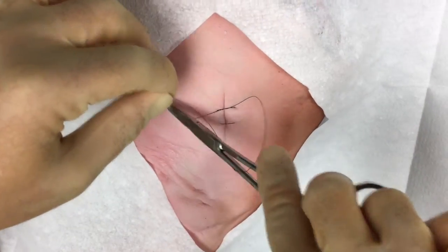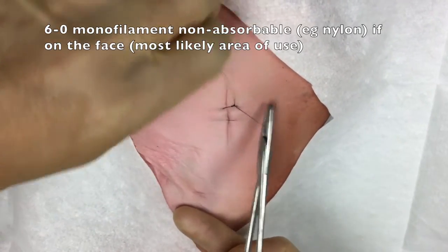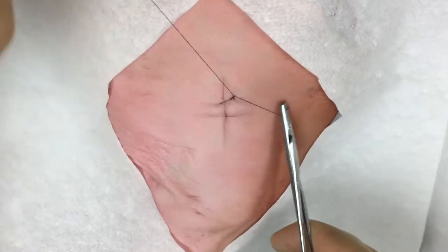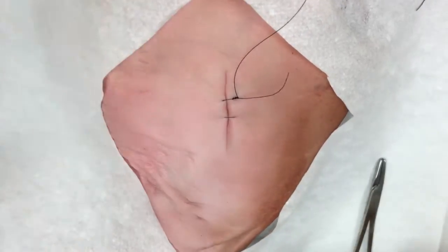The inverting horizontal mattress suture is somewhat of a niche technique in that it creates marked inversion of the edges of the wound, which is generally not a desirable feature in the closure of a traumatic laceration, but occasionally it can be an effect that you're trying to achieve.